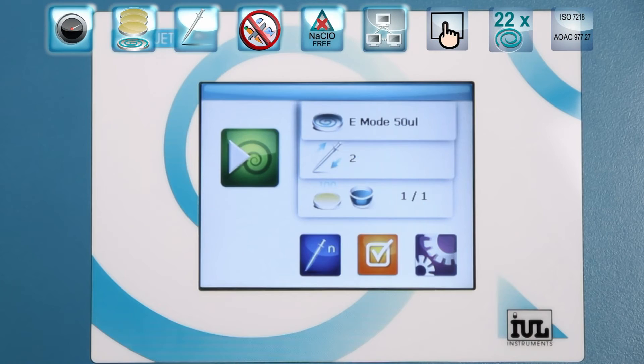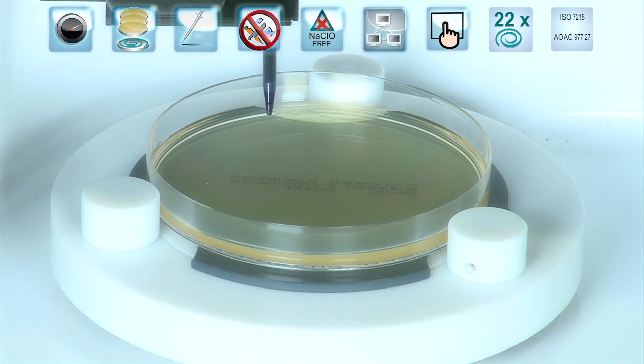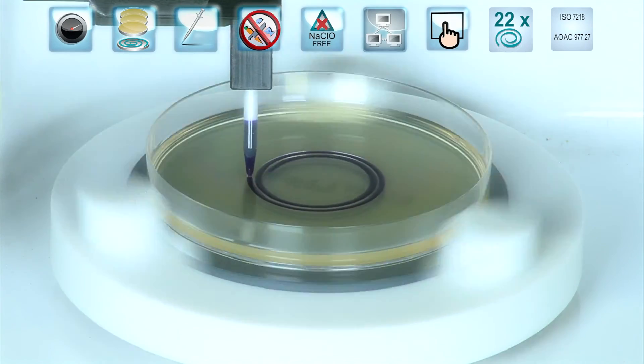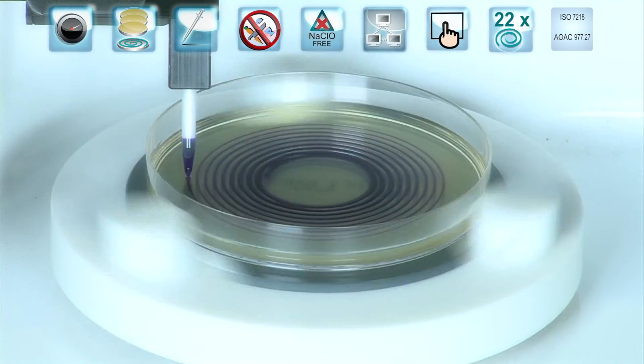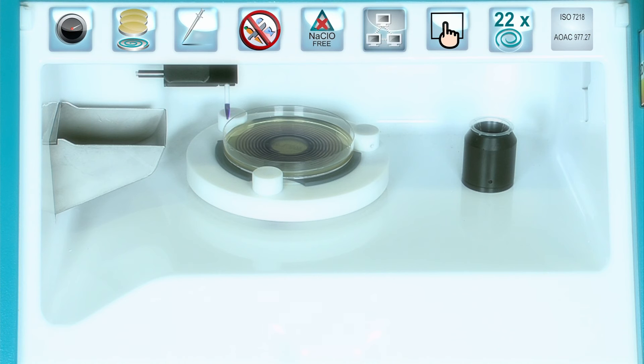EDIJA II's streamlined intuitive software is commanded from a color touch panel. IUL also improved spread times in this device. EDIJA II stands out as the spiral plater with the widest range of spiral distributions, making up to 22 of the most used distributions.